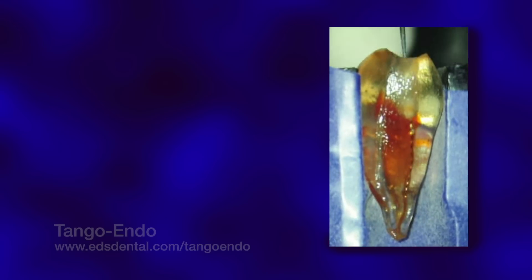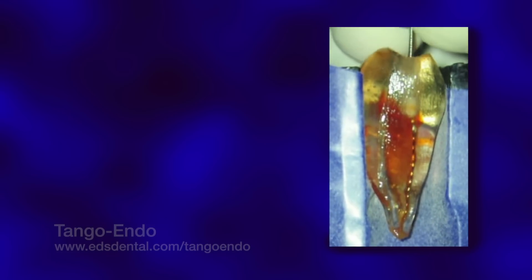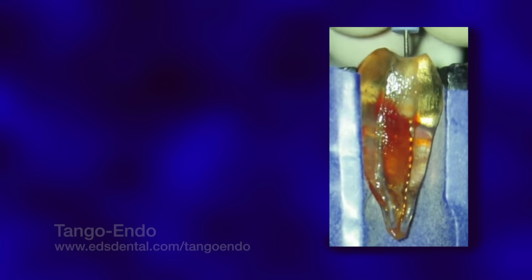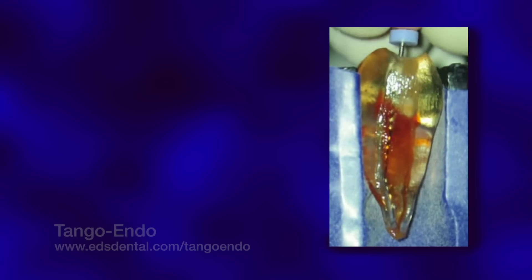The next step is to irrigate the pulp chamber, introducing a reservoir of irrigant — 17% EDTA or 6% sodium hypochlorite — that will lubricate and disinfect the canal as we manually negotiate a 06-tipped, 02-tapered stainless steel safe-sider to the apex. Please note that modified reamers are far more efficient than the traditional use of K-files, because they encounter far less resistance along length, while shaving dentin away more efficiently, particularly in the buccal-lingual plane.